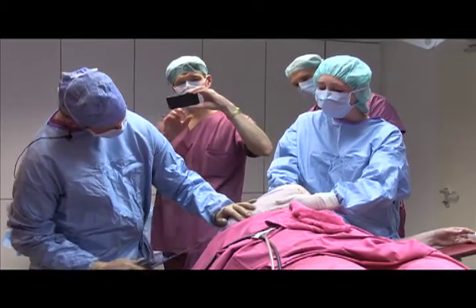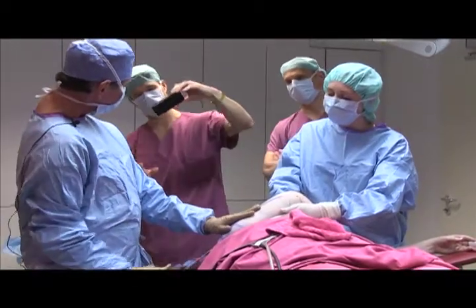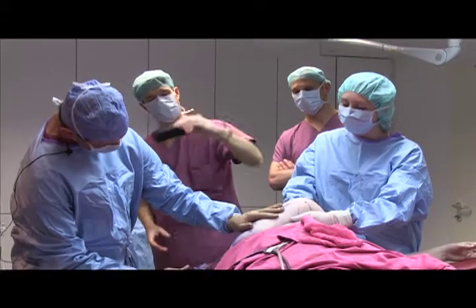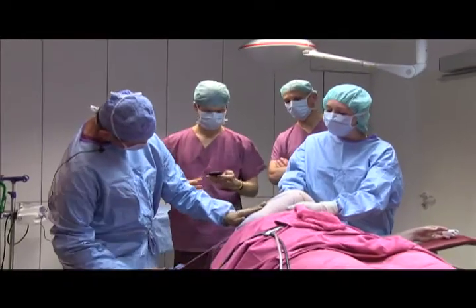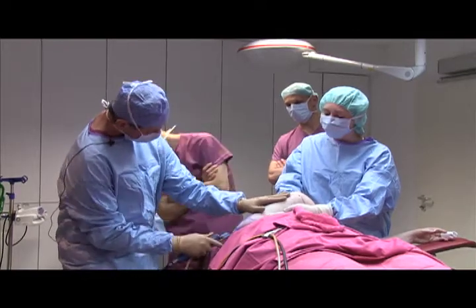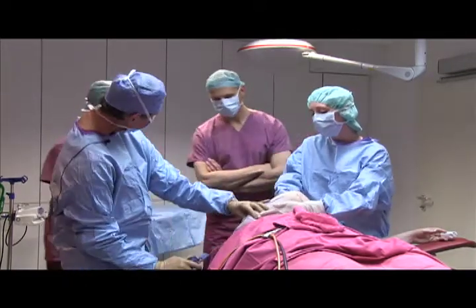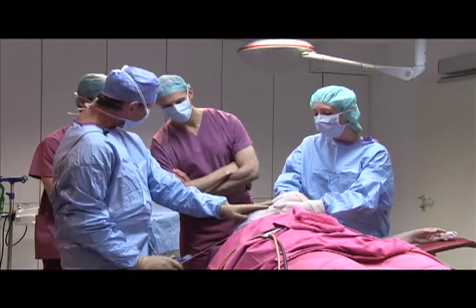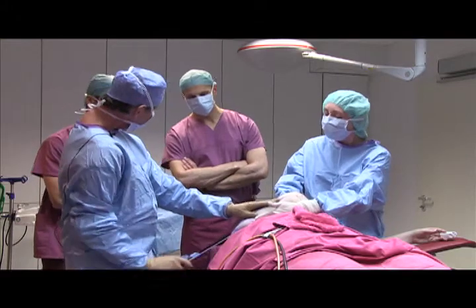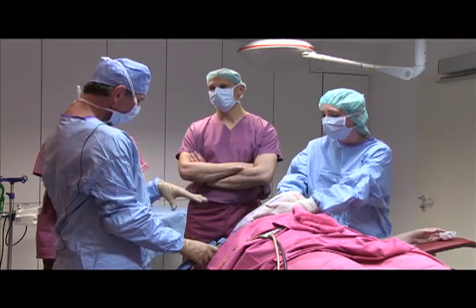I never use any force. I really want you to see what happens: the more I deflate the upper arm, the more flexibility will arise. If I go below the fascia, suddenly I have adherence again — so I have touched the gliding plane.